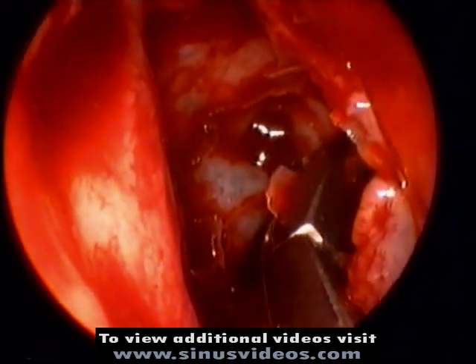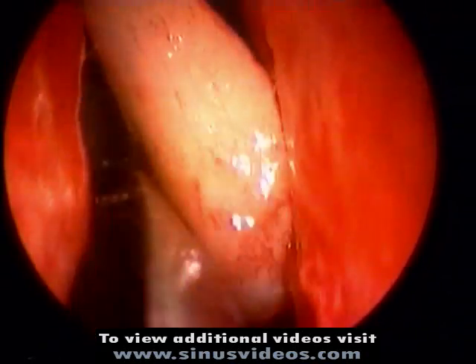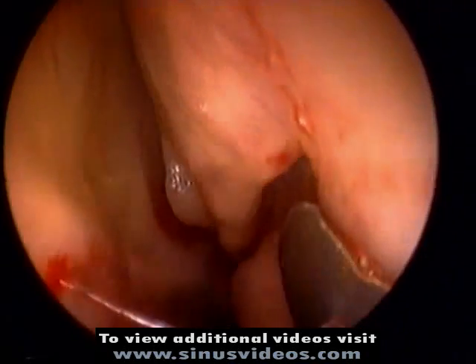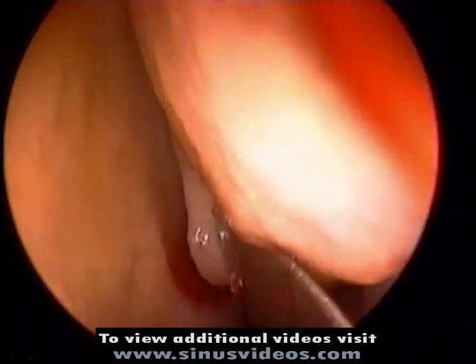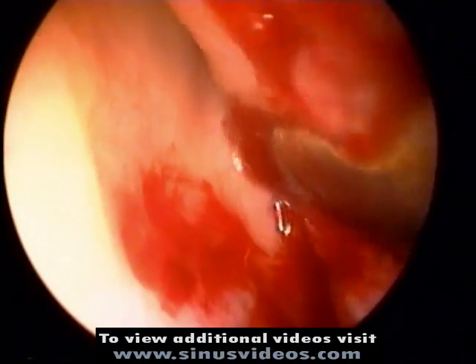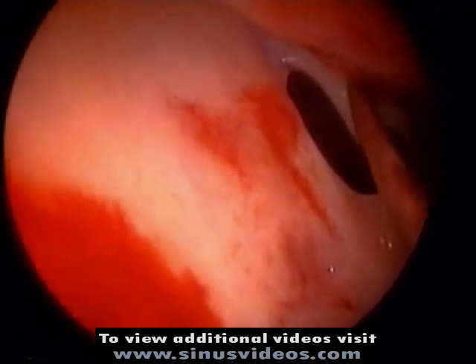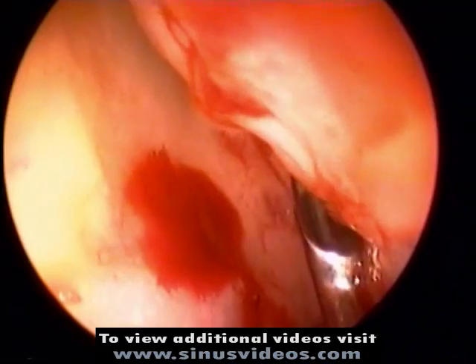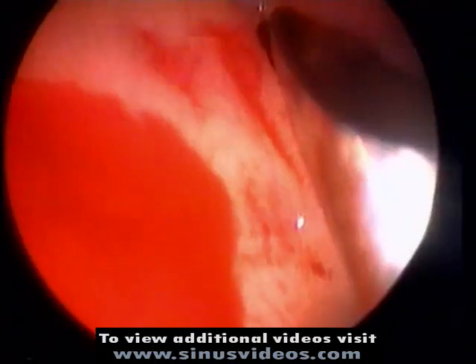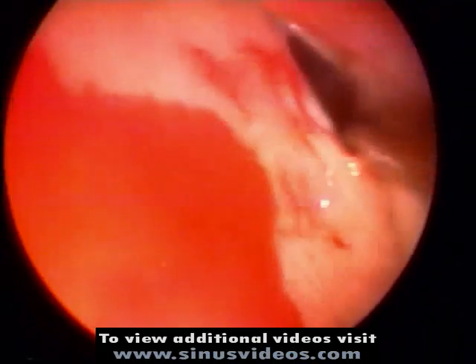The lamina papyracea is skeletonized. And again, the natural ostium of the sphenoid sinus can be identified by reflecting the middle, superior, and in this case as well the supreme turbinate in a lateral direction. In the sphenoethmoid recess, we see the natural ostium of the sphenoid sinus. This can be enlarged in an inferior and medial direction if necessary.